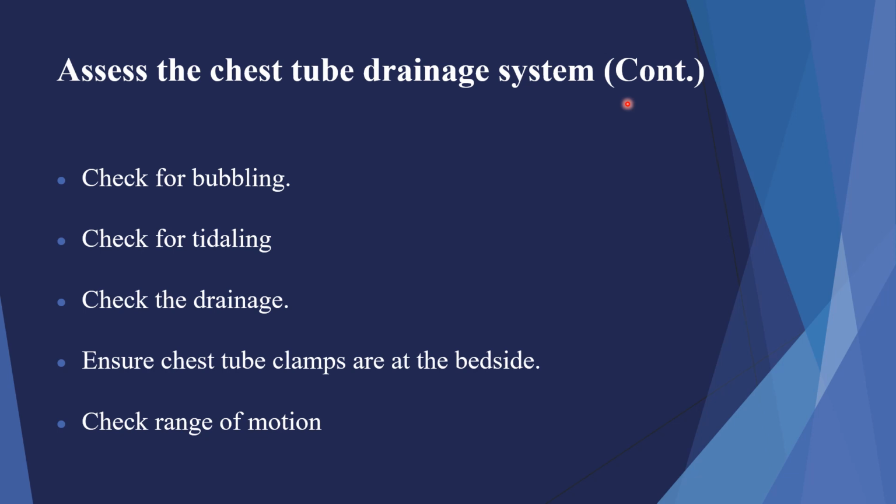Another thing that you need to check for is how much, when we're checking the chest tube, the drainage in that chest tube, we want to make sure that that chest tube drainage system is not getting overfilled. If it's getting close to hitting that 2 liters where it's filled, we need to consider changing that out, okay? So those are just some of the things we're going to look for.